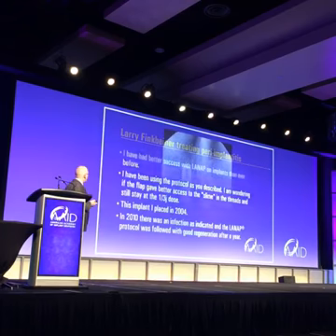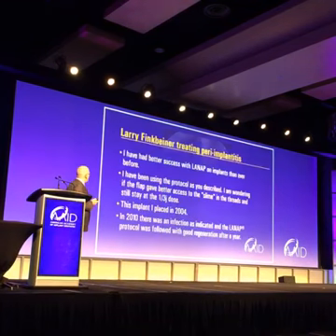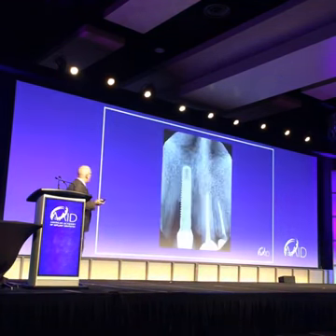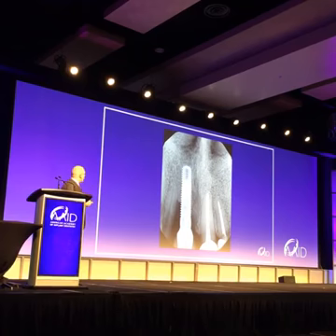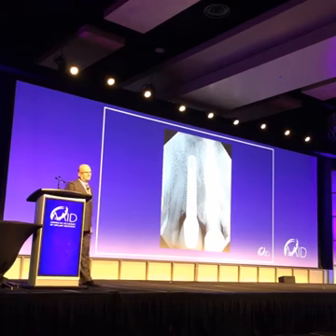Dr. Larry Finkbeiner placed the implant. In 2010, he saw that they had an infection. Again, it's an anterior implant. How are you going to flap this without ruining the aesthetics? He went ahead and treated it. Over the course of a year, it went from that to that to that.